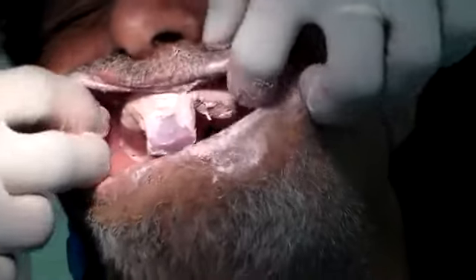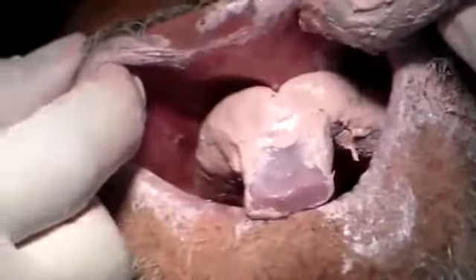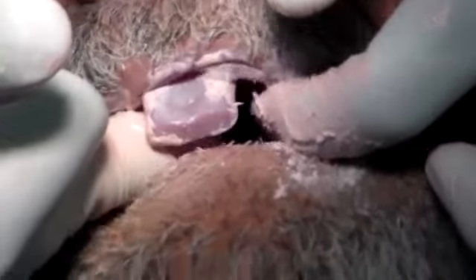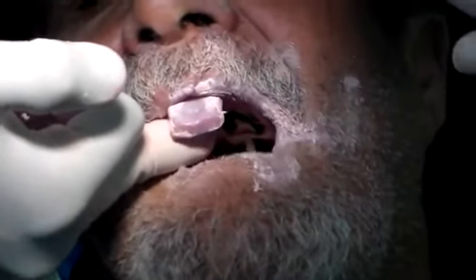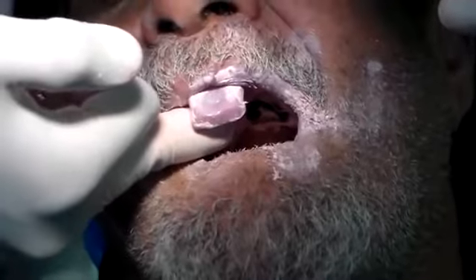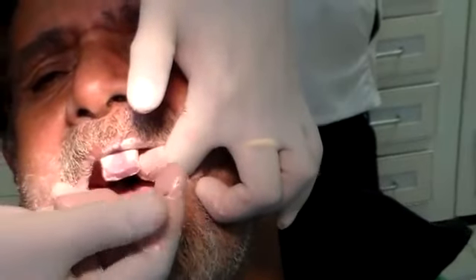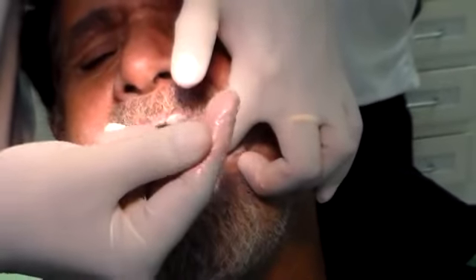At this point, when you look inside, you can see areas of green. You know that your green stick material is visible through the impression. When you take out the impression, the zinc oxide material must be at the level of the green stick. Wait for the material to set — it's still setting. Now the material has set; I can make the material into a ball.